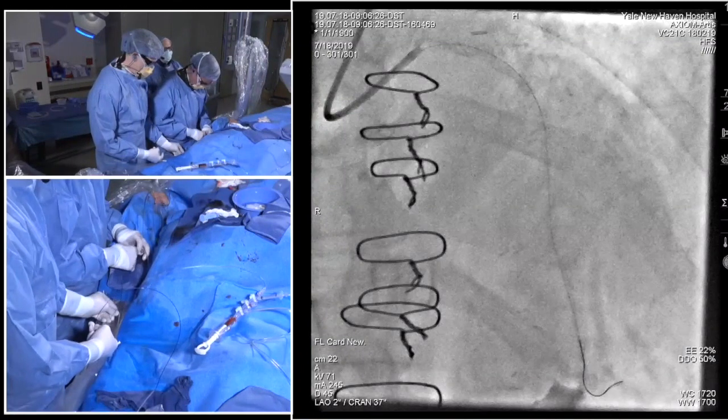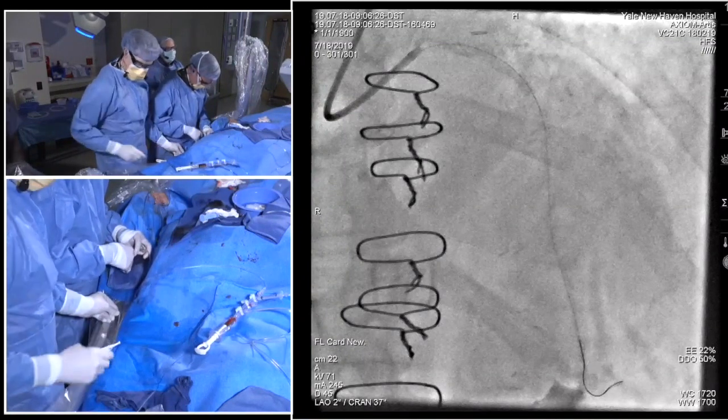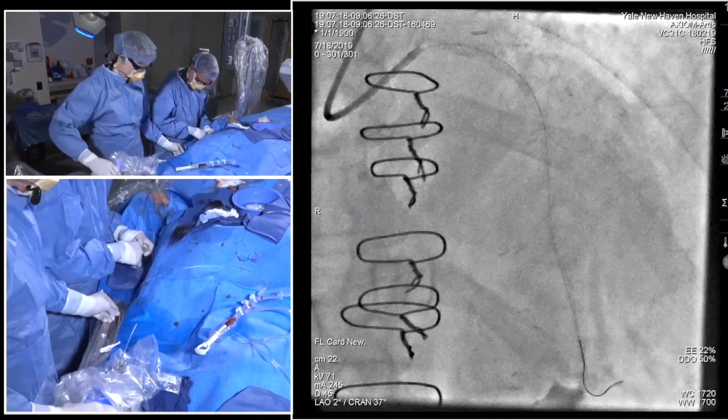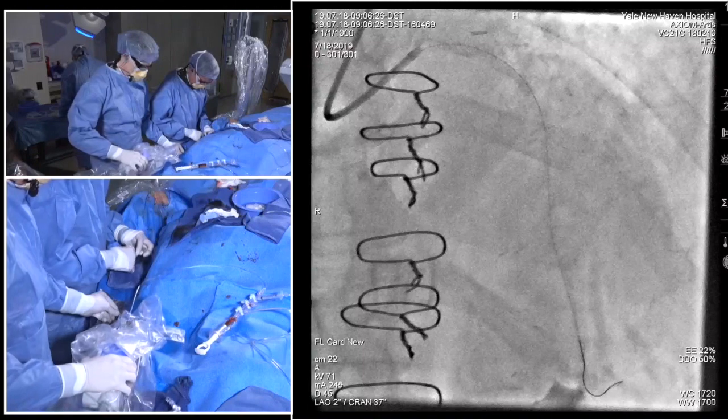And the truth is, with the old-fashioned way of just doing atherectomy across a branch, you almost never lose the branch because you're debulking at that branch. So that's kind of how I would think about it.